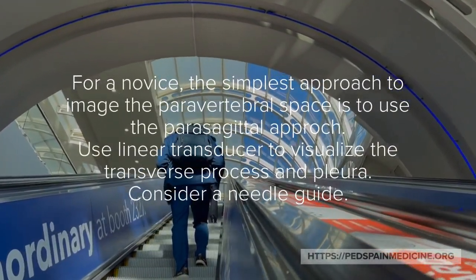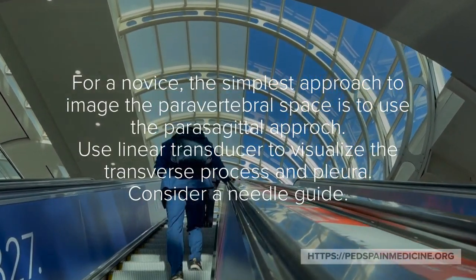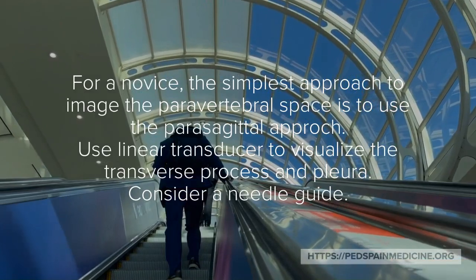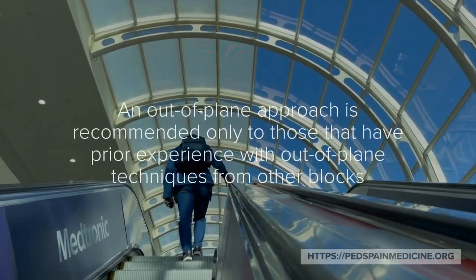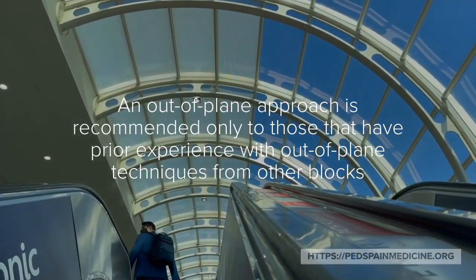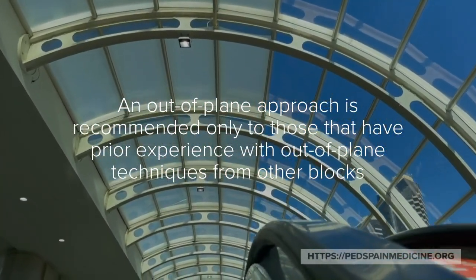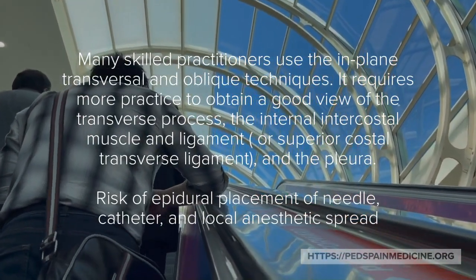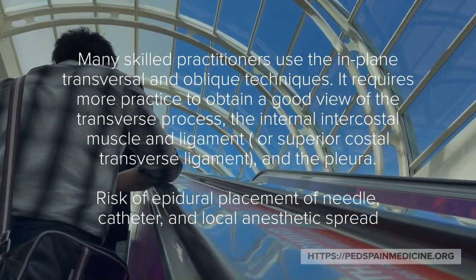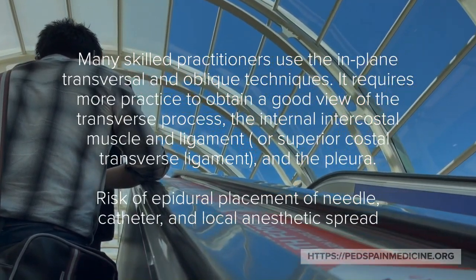For a novice, the simplest approach to image the paravertebral space is to use the parasagittal approach. Use the linear transducer to visualize the transverse process and pleura, and consider a needle guide. An out-of-plane approach is recommended only to those with prior experience with out-of-plane techniques from other blocks. Many skilled practitioners use the in-plane transversal and oblique technique, though it requires more practice to obtain a good view of the transverse process and other structures. There is a risk for epidural placement of the needle, catheter, and local anesthetic spread.